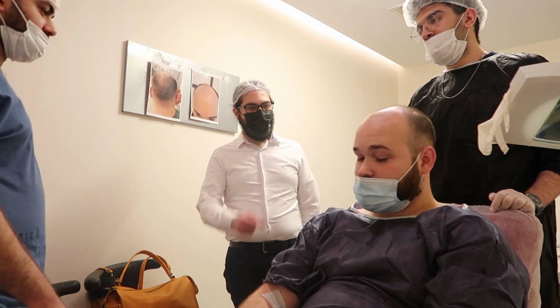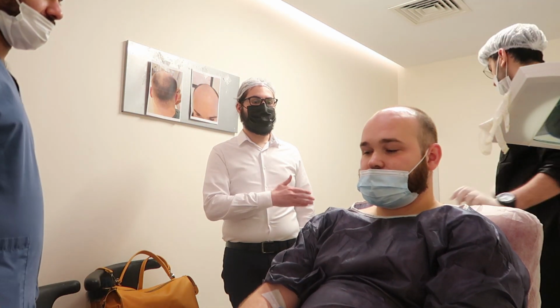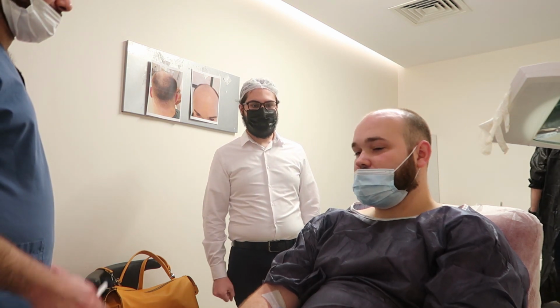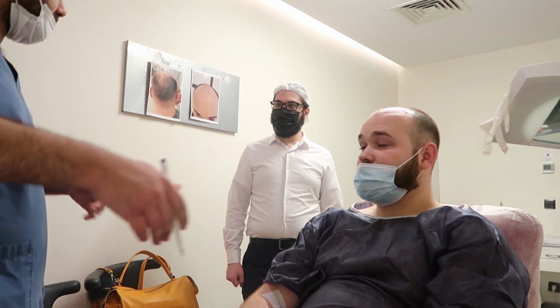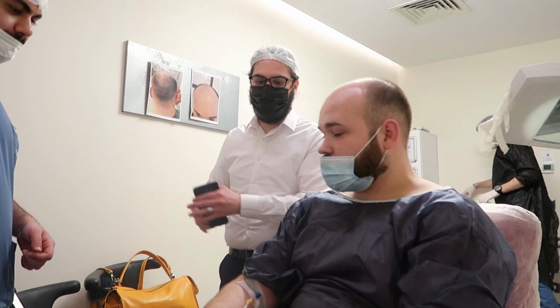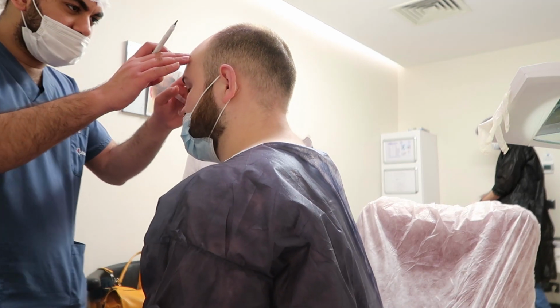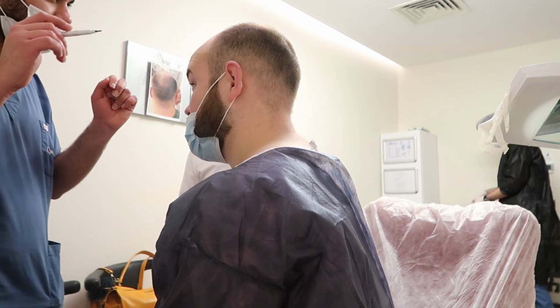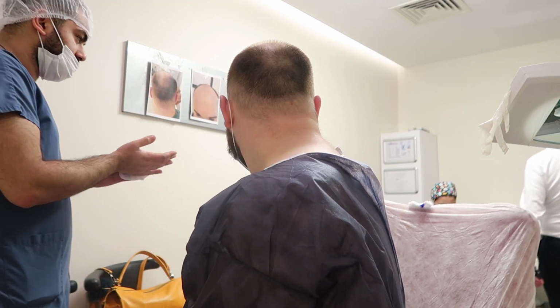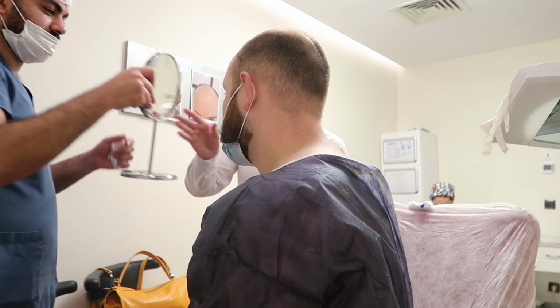They're gonna right now make the lines so you can see where the surgery, the transplant will start and where to end. Okay. Can you look at him? So you can sit towards like him. Can you make like this? Yeah. You can look right now.